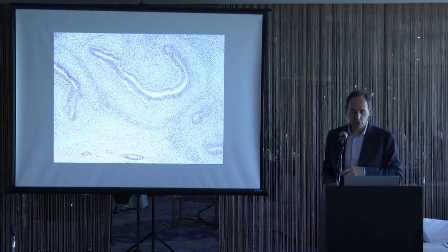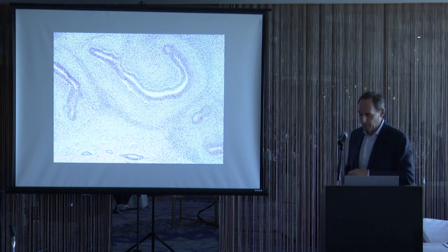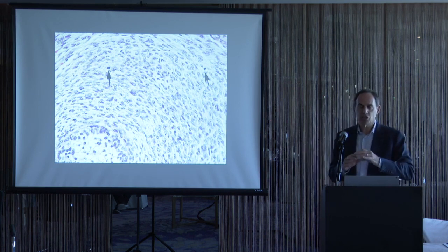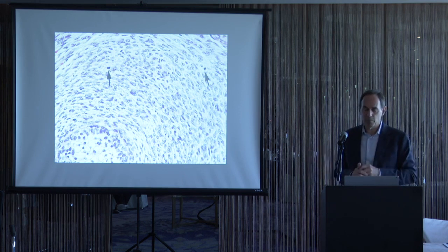Very commonly in teratoma, around some of the glands, one can see a very cellular stromal component that basically looks like sarcoma. Highly cellular, highly mitotically active. It's basically in situ sarcoma. It's cuffing the glands, and as long as it's not sheeting out greater than a 4x field, it's, again, just part of the post-pubertal teratoma. You don't mention it.